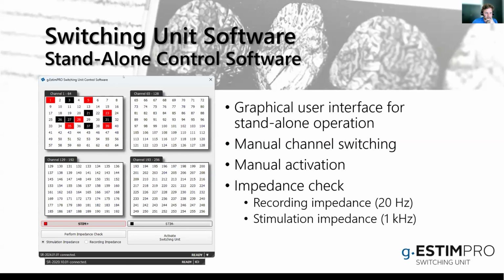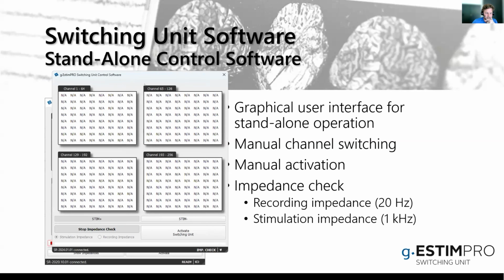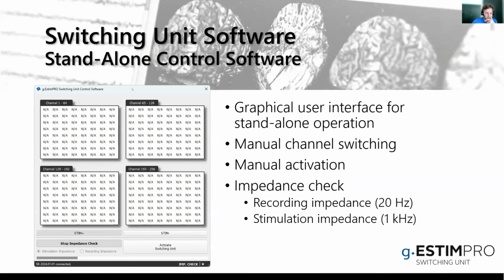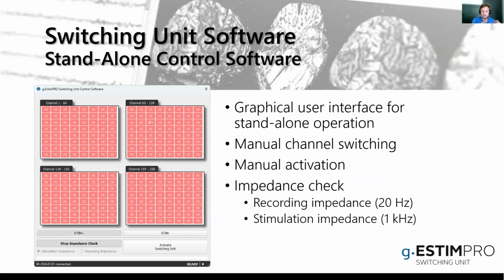Good, so now this is just for demonstration purposes, and there's no stimulation going on. But what this app also features, and it's quite nice, is an impedance check. So I can record or measure the impedance of the electrodes in real time. So this gives a very important information about how the electrodes are connected, because you cannot stimulate into electrodes which are not connected at all, because you're not able to put the current through the leads if they're not connected.